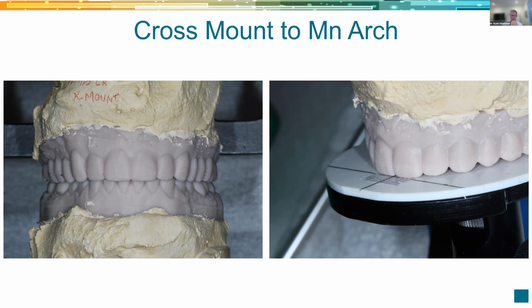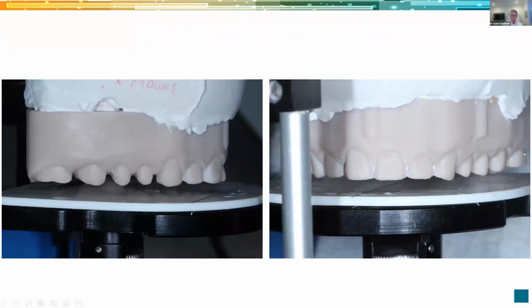I know I have my length. I've got my midline on. It's good. It's straight, back to front. The AP is level. Everything's down. We're looking good. Here's how the preps look on there. We got this cross mounted.